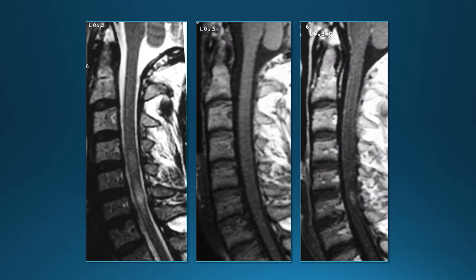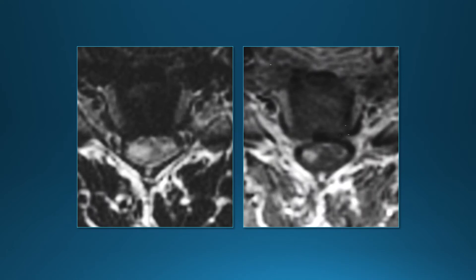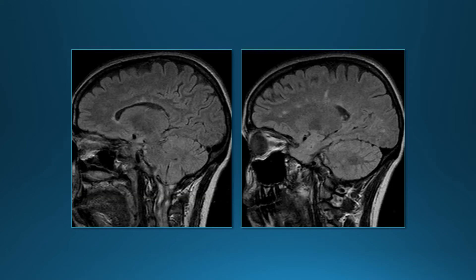Another patient with multiple sclerosis shows a little bit of cord expansion — an enhancing active lesion can sometimes cause cord expansion. Axial images again show involvement of the spinal cord white matter, and on brain imaging we see the typical Dawson's fingers.